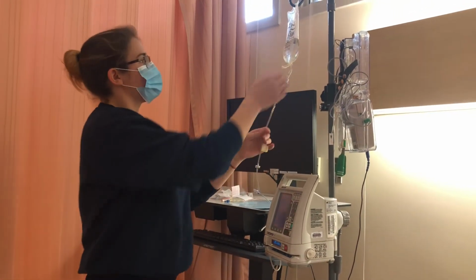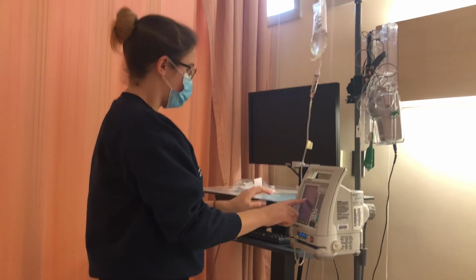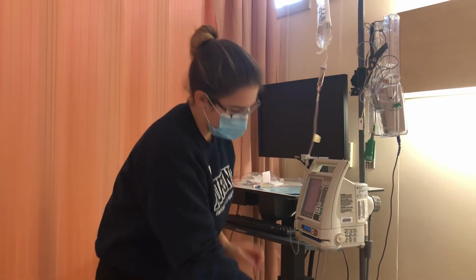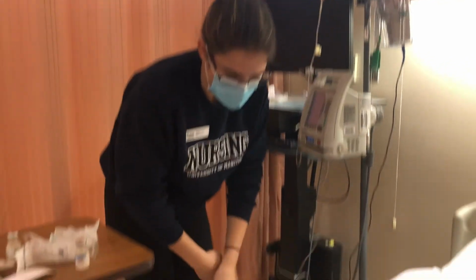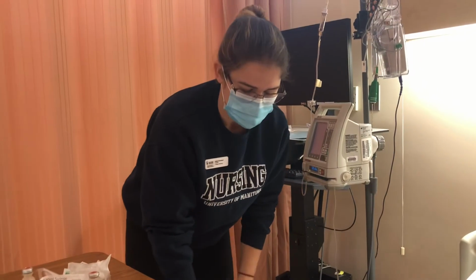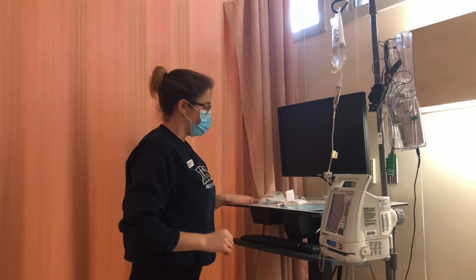So I'm just checking my primary rate, making sure that it's running. It was supposed to be going at 25 cc's per hour, and it is. Just checking for any bubbles, following the line down, making sure everything's open and running. Asking the patient if they have any pain, swelling, or redness at the site, and there isn't any, so it's good. So my site's been checked.